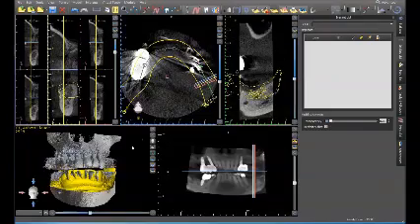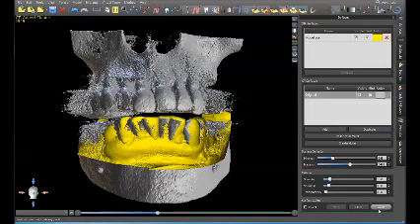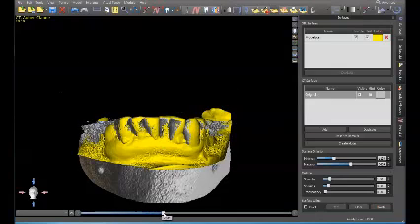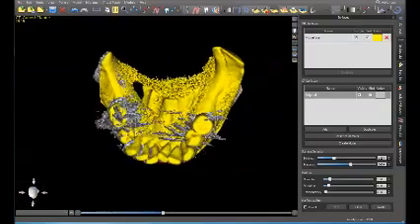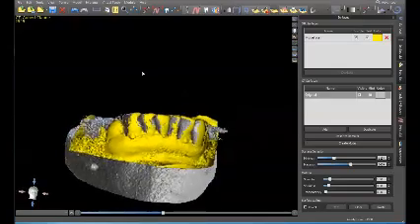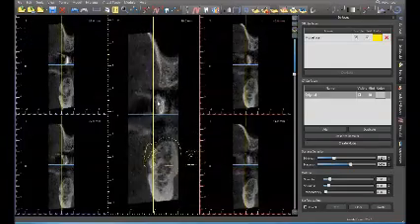Let's take a look at it again. What you want to see is, let's take off the surfaces, isolate, lower. You kind of want to see this gray go through a little bit of the color on both sides. That usually means you have a pretty good stitch. It blends pretty well, but we can double check once again to make sure it's perfect.